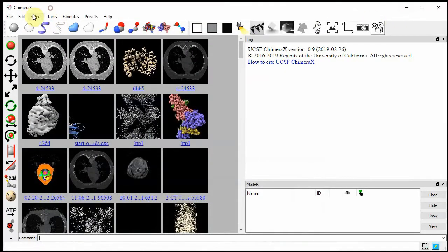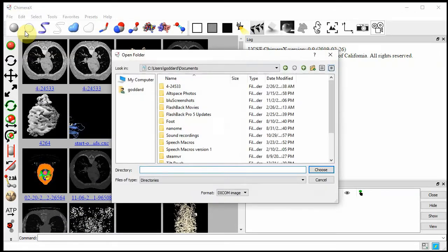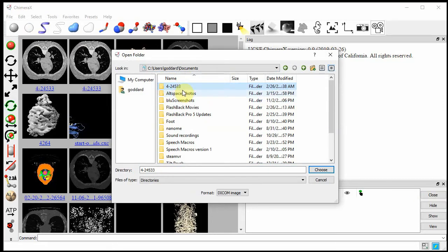I'll open the data with file, open DICOM folder. I downloaded the data into documents, it's this folder 4-24533. I choose just the folder. Within the folder there are a few hundred DICOM data files for individual planes of the data, but I just choose the folder.